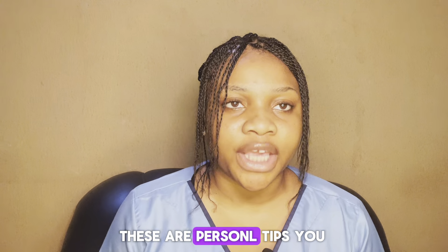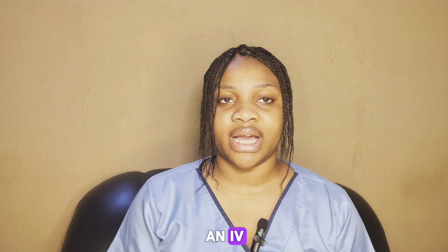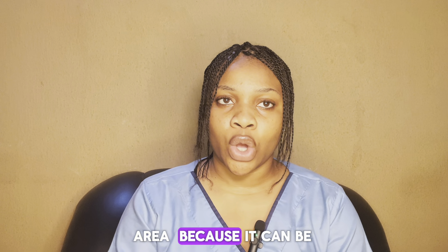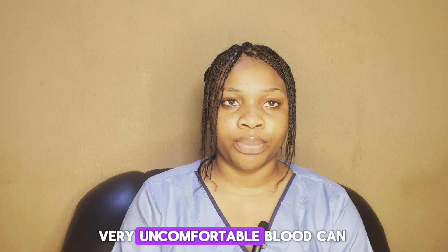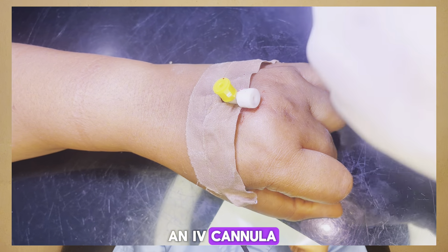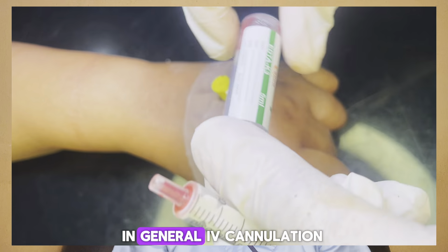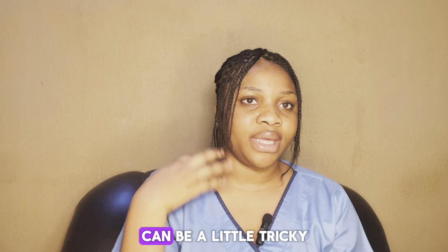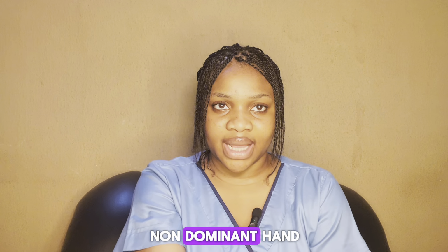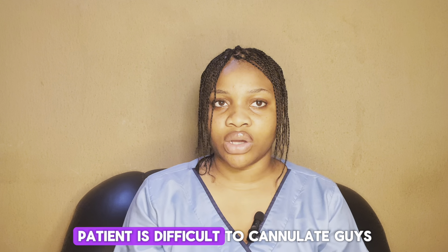These are personal tips you can always have at the back of your mind whenever you are setting an IV cannula. One, avoid cannulating at the joints area because it can be very uncomfortable. Blood can be taken the first time you put the IV cannula. Remember to flush after connecting it to prevent blood clots. In general, IV cannulation can be a little tricky, but remember, hold the skin taut with your non-dominant hand. Involve seniors if the patient is difficult to cannulate.